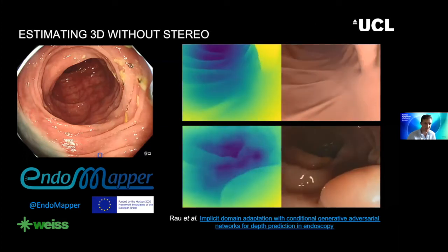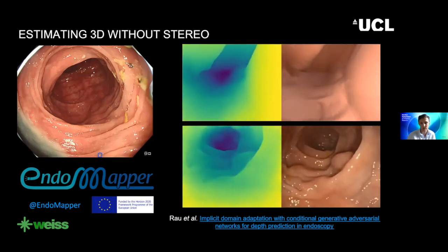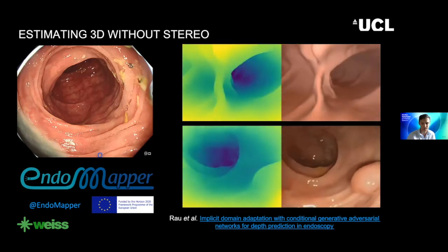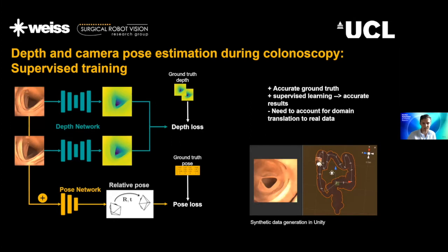And we now have a really exciting focus project called EndoMapper, where we're in a European consortium led by the University of Zaragoza, where we're developing vision systems to advance what is possible in endoscopic vision like this. Of course, estimating depth is just the beginning. Ideally, what you want is to be able to estimate depth at each point where the camera traverses a particular anatomy, and then estimate all of the camera poses and really reconstruct the full geometry of that anatomy. So take, for example, a colonoscopic video and generate a full 3D reconstruction with all of the camera poses and the full 3D colon model, in order to understand what has been observed and what hasn't. And I think we're making some advances towards achieving this.